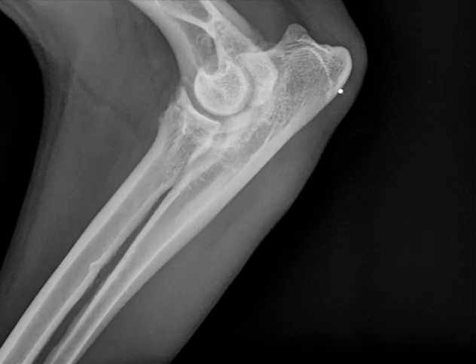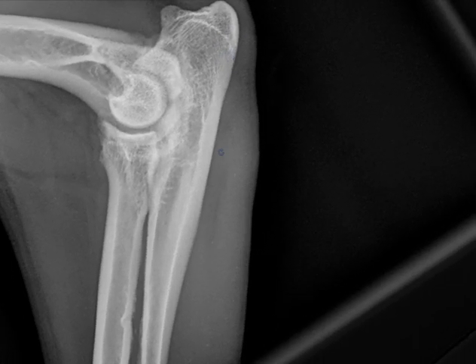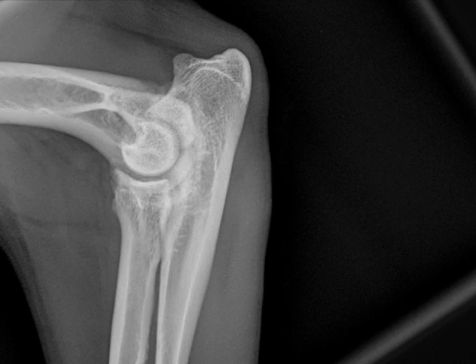However, on the left side for this patient, it's perhaps a little more obvious. The step that we're referring to is in this region here, where we go from having a wider aspect of the joint space to a much more narrow joint space. Some other minor findings include sclerosis of the trochlear notch.